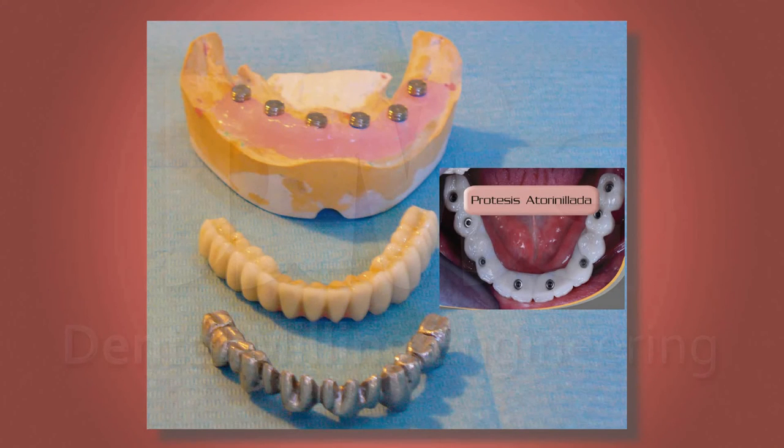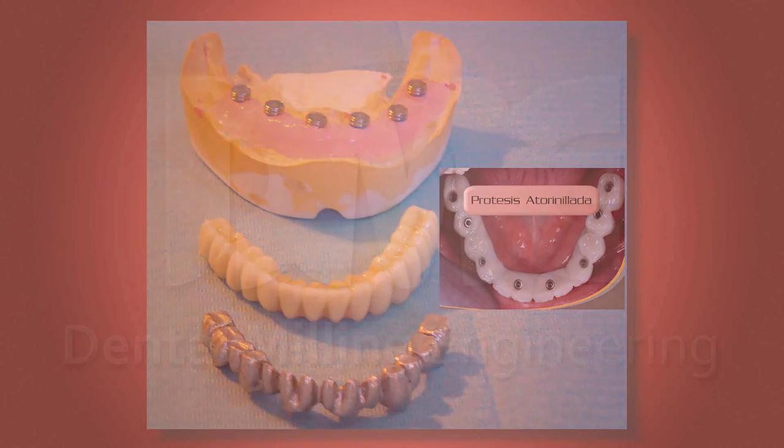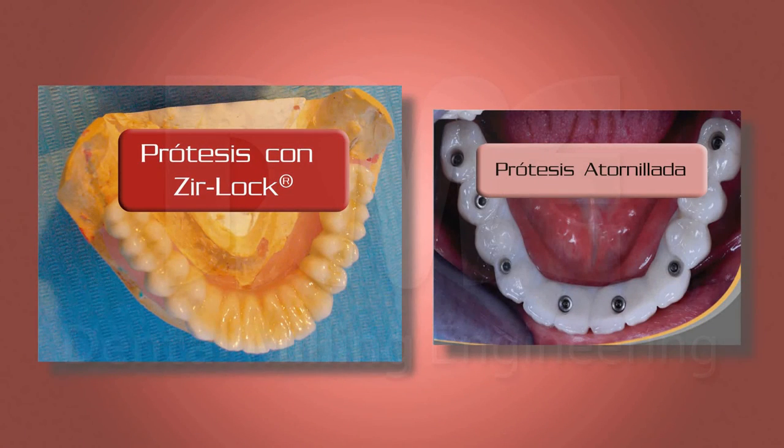In this slide, the finished prosthesis is observed. As was already mentioned in the video presentation, one of the greatest advantages of this type of work is that there are no holes in the occlusion of the prosthesis. It means that the doctor will not have to seal these holes, as happens with directly screwed prostheses.